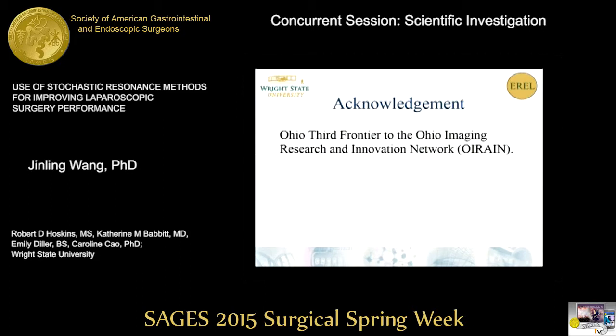A very interesting problem that all of us deal with. I had a question about how a lot of the feedback is dependent upon how much pressure you put on whatever object you are trying to identify, because we use some of our own experience from open surgery. But with the instrument, how much pressure do you have to apply in order to get potential feedback, to be able to feel exactly what that tumor is or is not, or if it's even there?